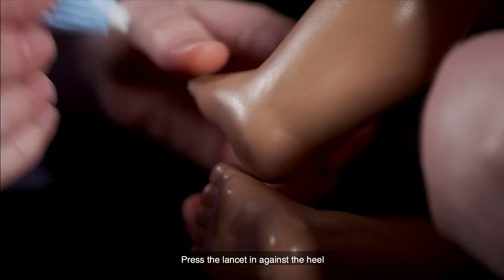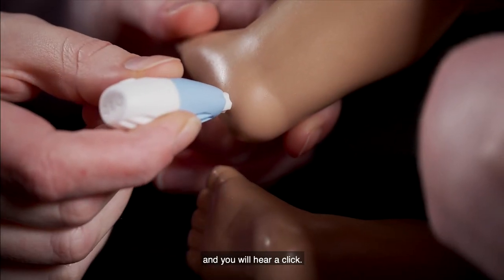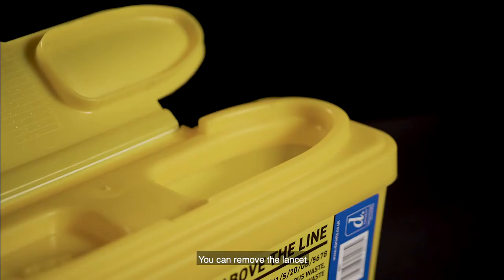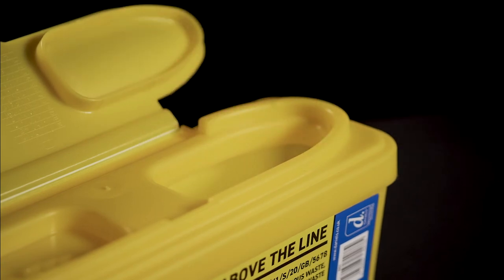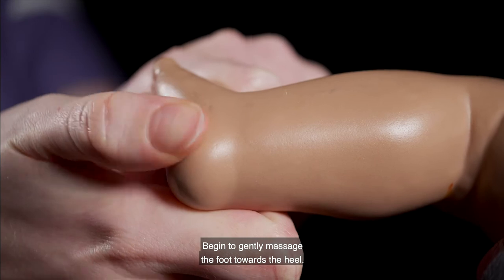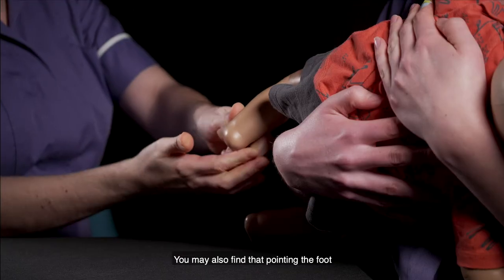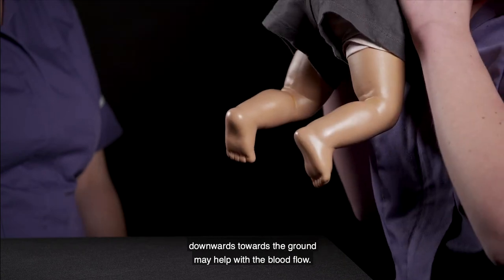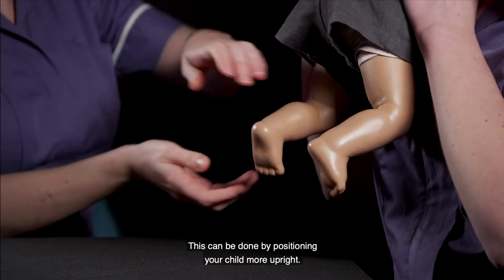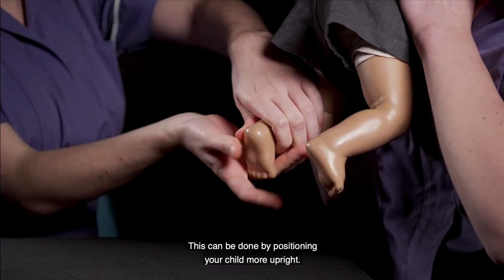Press the lancet in against the heel and you will hear a click — this has pierced the skin. You can remove the lancet and place it safely into the sharps bin. Begin to gently massage the foot towards the heel. You may also find that pointing the foot downwards towards the ground may help with the blood flow, which can be done by positioning your child more upright.